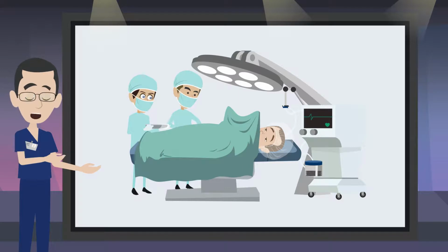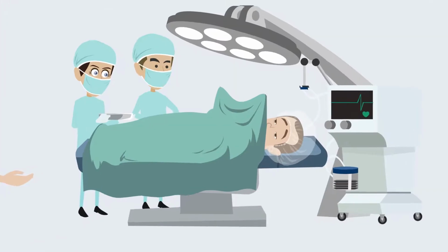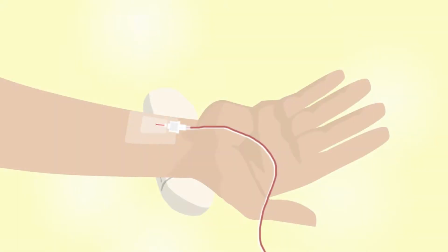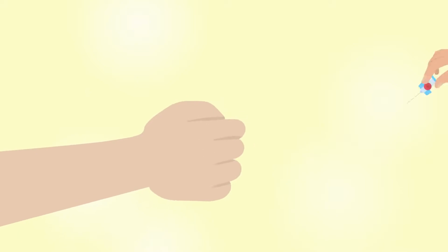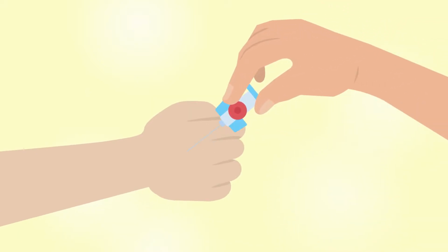When the surgery is very delicate, or when the patient's condition is very demanding, it may be necessary to also place arterial access, or put a plastic cannula inside one of the arteries, usually the upper limb, in order to control blood pressure, instant by instant. At this point, the patient is ready for surgery.